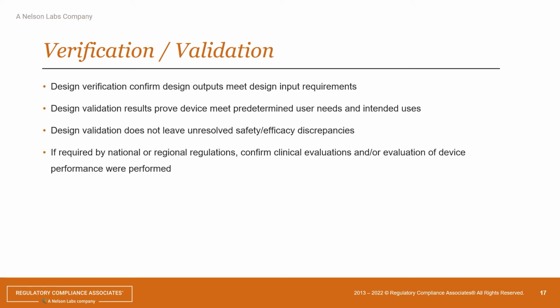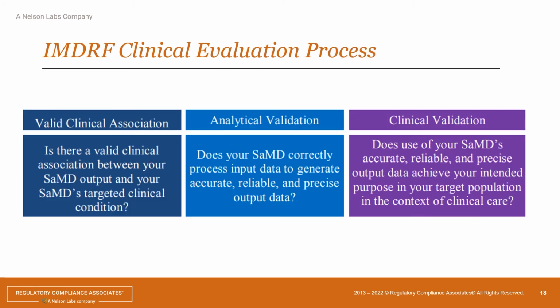But the IMDRF came up with these buckets of how you go about clinical evaluation. The first bucket is all about you doing clinical evaluation, doing a literature search, comparing it to other devices that do the same sort of thing, and figuring out what you need to do, and then how that establishes your software as a medical device.